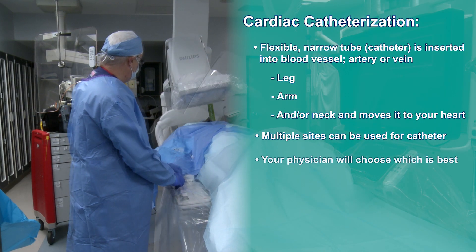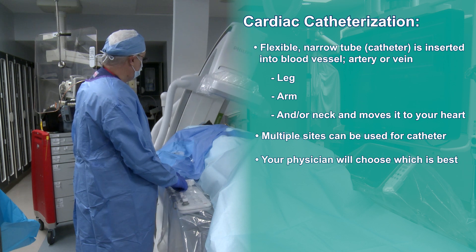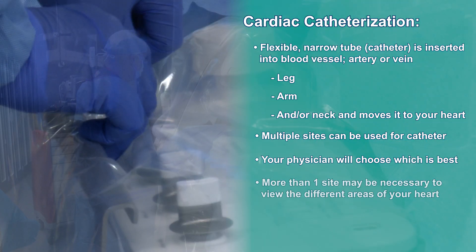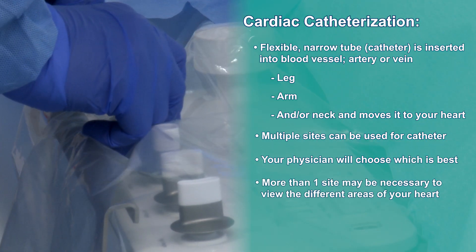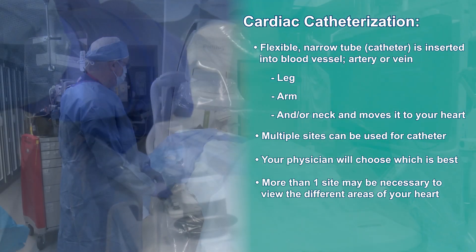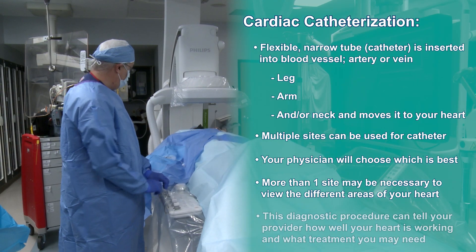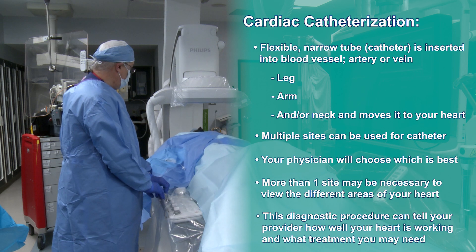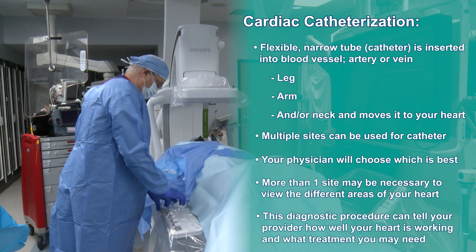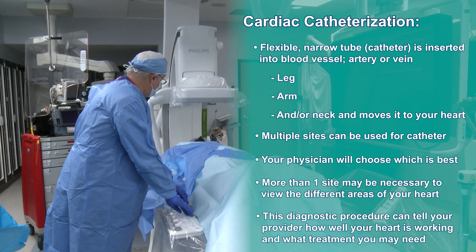Your physician will choose which site is the best and safest for you. More than one site may be necessary to view the different areas of your heart. The diagnostic procedure can tell your provider how well your heart is working and what kind of treatment you may need.